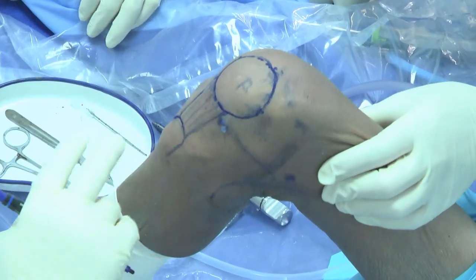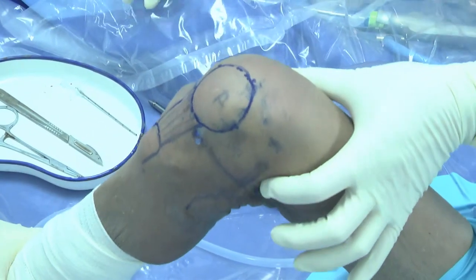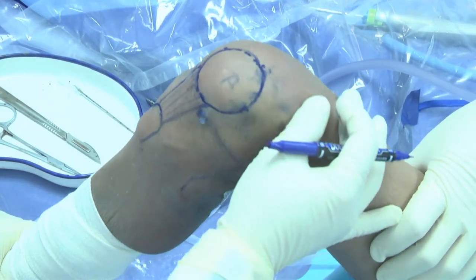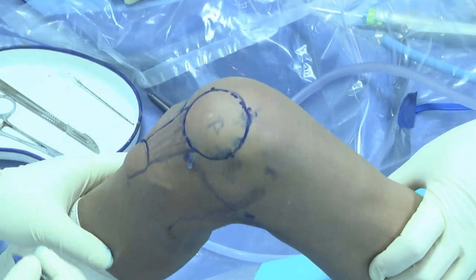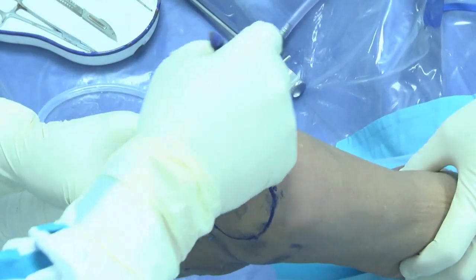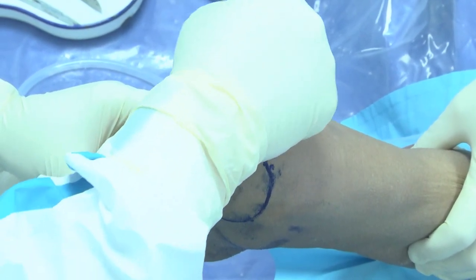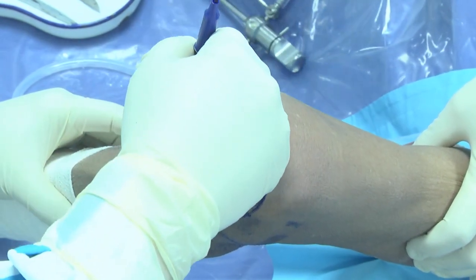Okay, good. But I think we harvest the graft first, because the joint is not swollen yet and we can see better. So the next step is we will harvest the hamstring. You need to know that there is another branch from here. This is the saphenous nerve. The saphenous nerve has two branches. One branch goes here.